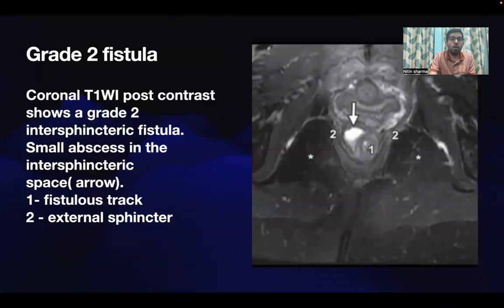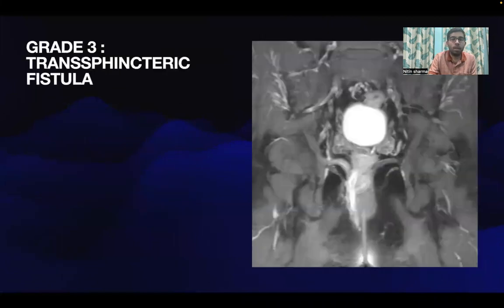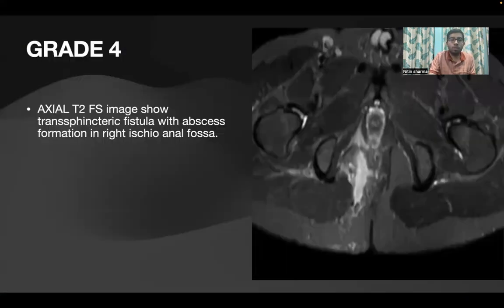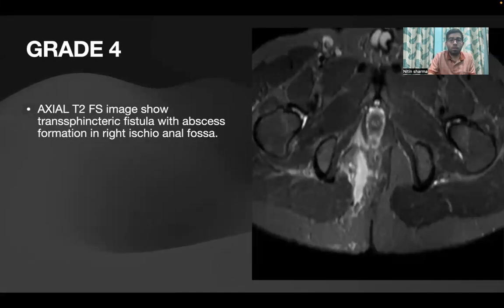This coronal T1-weighted post-contrast image shows a grade 2 intersphincteric fistula; a small abscess is also noted in the intersphincteric space. This is a grade 3 or transsphincteric fistula, where the fistula track can be seen extending outside of both the internal and external sphincter. This is a grade 4 transsphincteric fistula with abscess formation in the right ischioananal fossa.